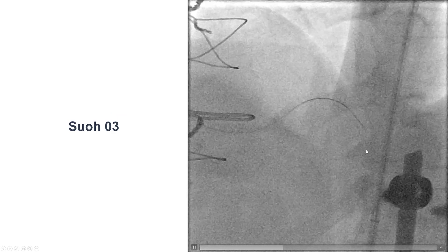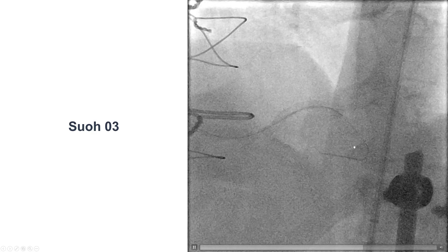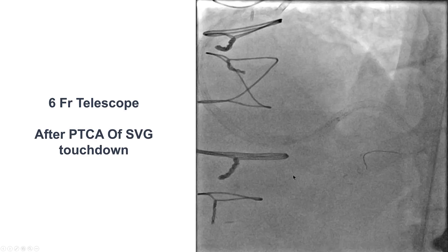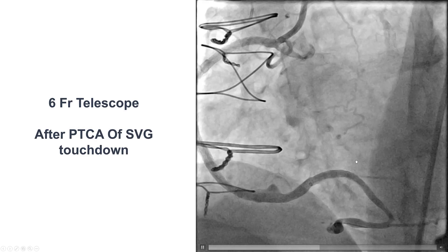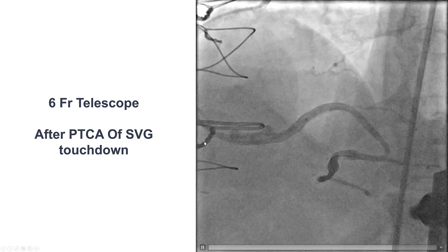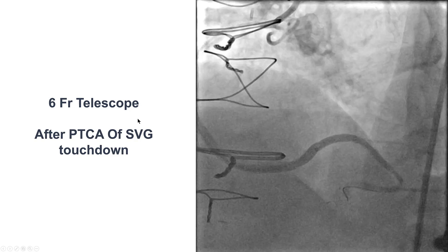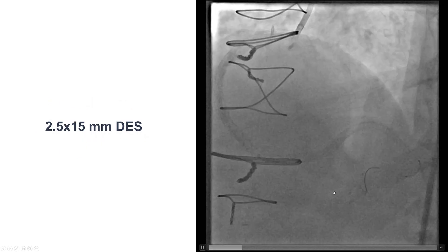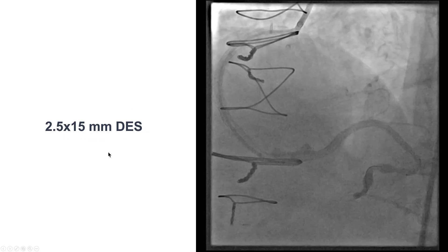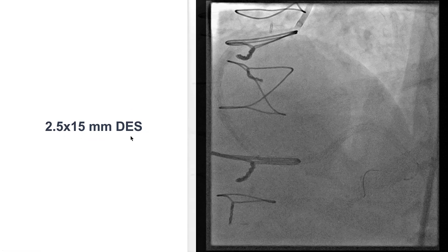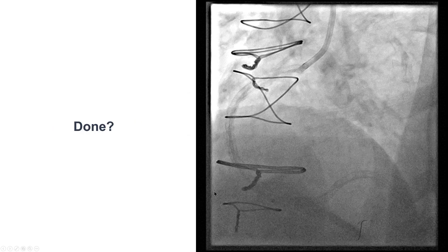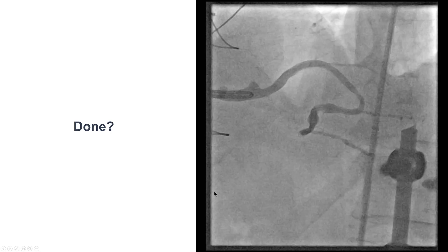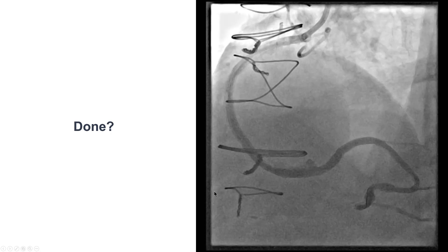This was verified by advancing a microcatheter and doing a more selective injection, which showed dissection or worsening of the lesion acutely at this touchdown of the skip graft. This can be very difficult to cross. We tried very soft SUO-3 guide wires and after multiple attempts were able to advance through that distal anastomosis of the saphenous vein graft. Delivery was extremely challenging. We eventually delivered a 6 French telescope almost all the way to the posterolateral, performed balloon angioplasty of the lesion, and were able to deliver a 2.5 by 15 millimeter drug-eluting stent across the touchdown, which restored TIMI 3 flow.